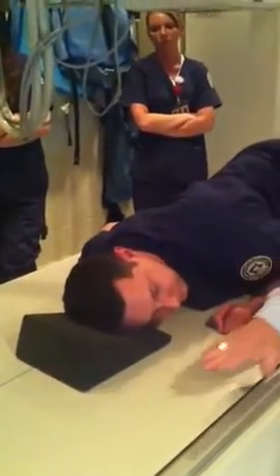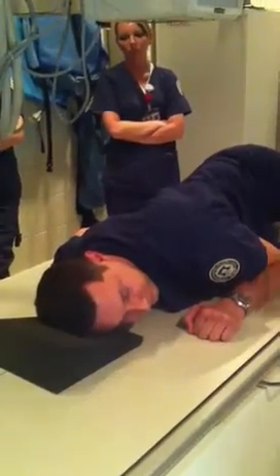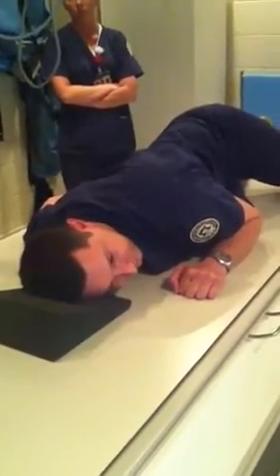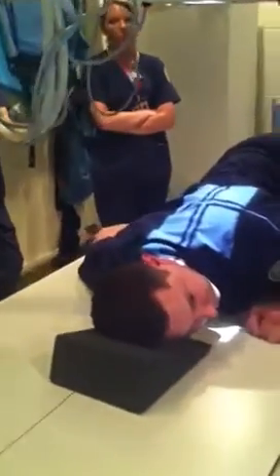So I maybe need to get a 15-degree angle sponge. A towel would work. Whatever you have available. Now you look at this, and now his head is parallel. His mid-sagittal plane is parallel. Okay? You look at this side. Is it parallel up at this end as well? Okay? So the whole thing is parallel to the image receptor. And we need to be 10 by 12.